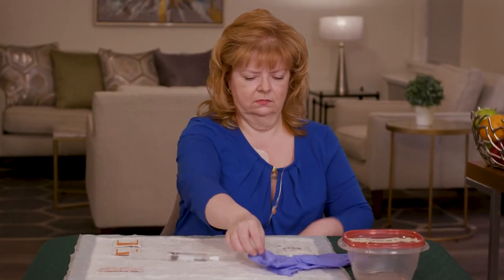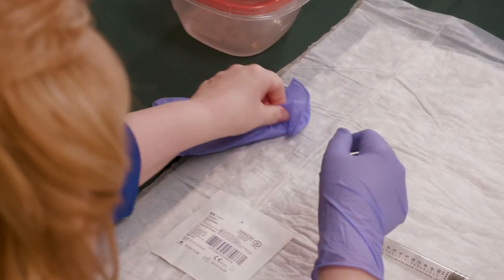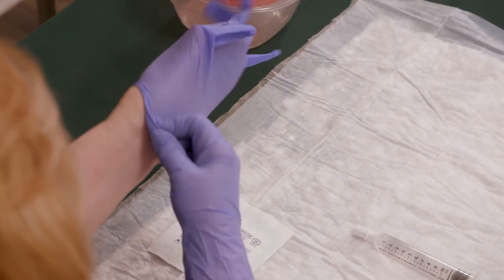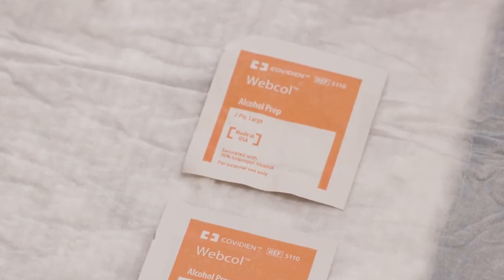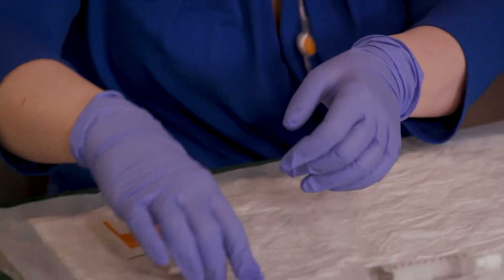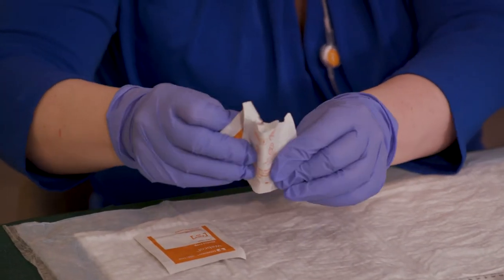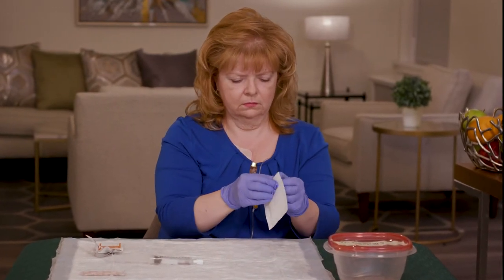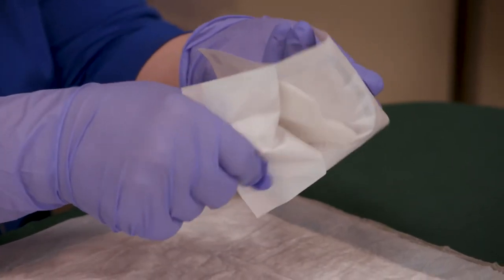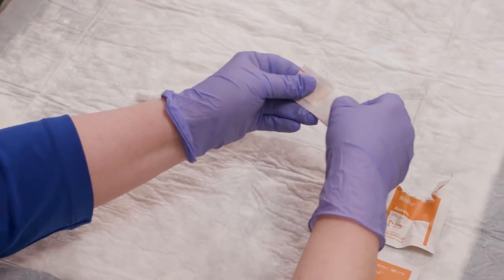Once your supplies are ready, put on the gloves. Open the alcohol pad, gauze pad, and bandage.